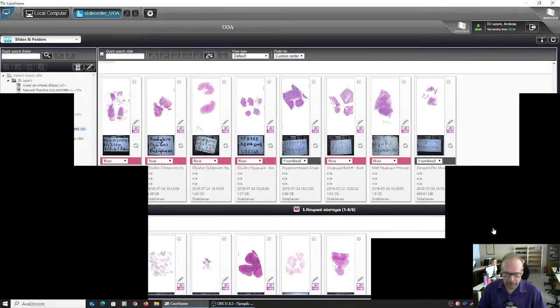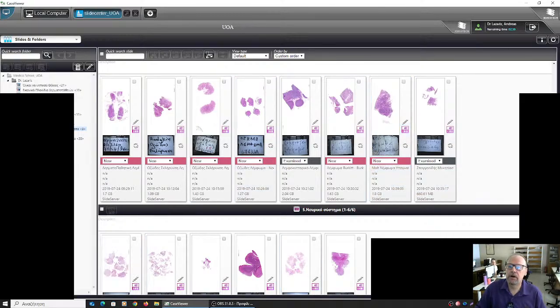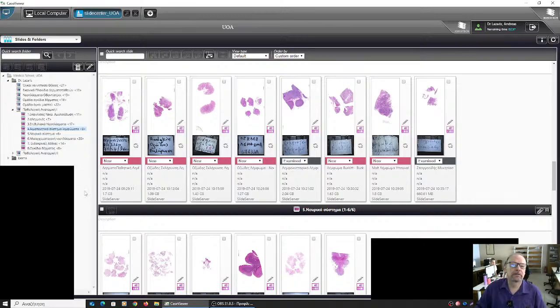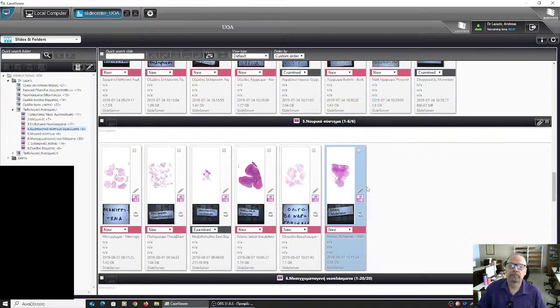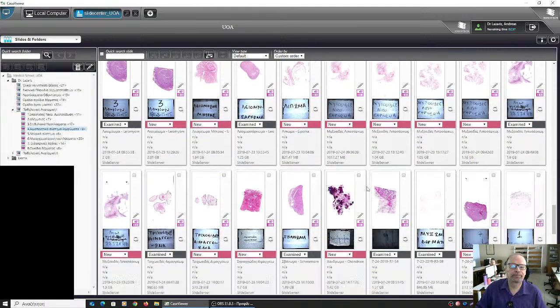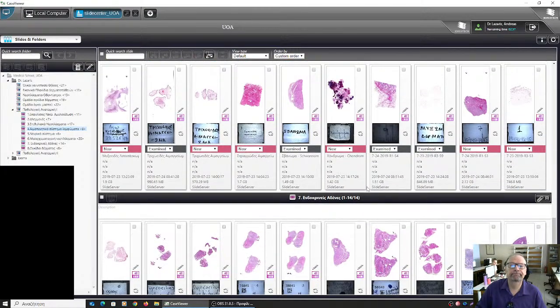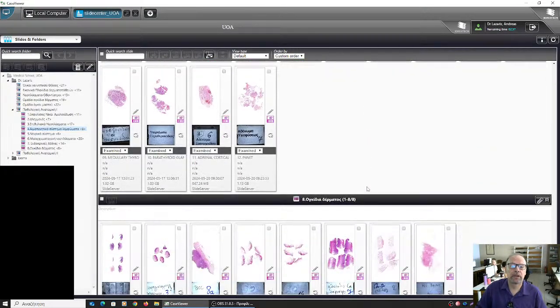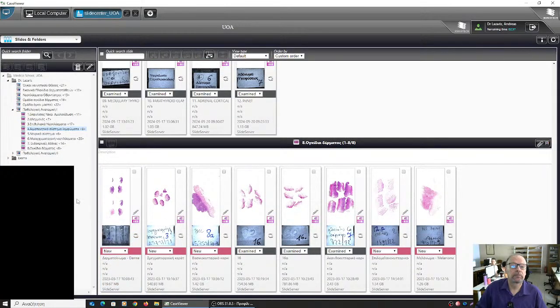Not all slides are present on the screen. Tell him to come. Some of them. Shall I start? Oh, it's like they gradually appear. Start from the skin and go backwards. Okay. Now.